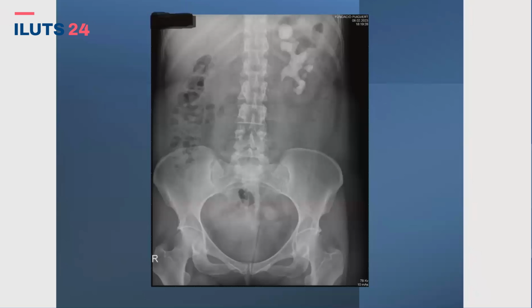The first thing to understand is the feasibility, the balance of all the risks and the information to the patient. That means that you cannot finish the case in one step like that. So you have to do multiple access. You have to be aggressive, of course. Your target is the complete clearance because it's an infection stone. I would treat the staghorn, maybe 2 procedures. And maybe in the second procedure, I will try to puncture anyway the diverticulum and leave a nephrostomy.